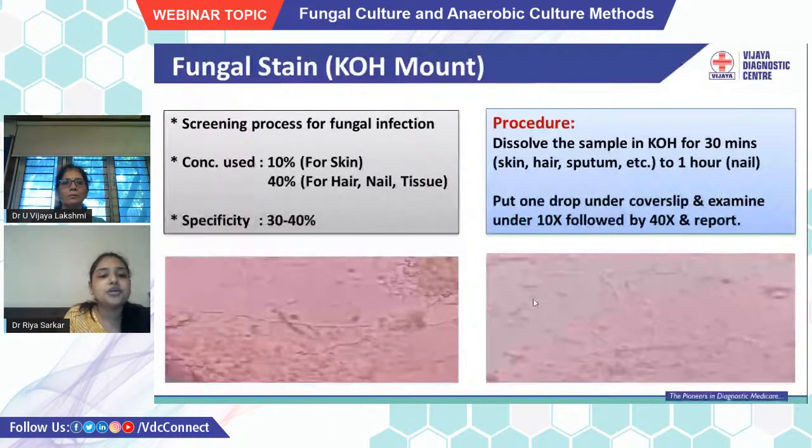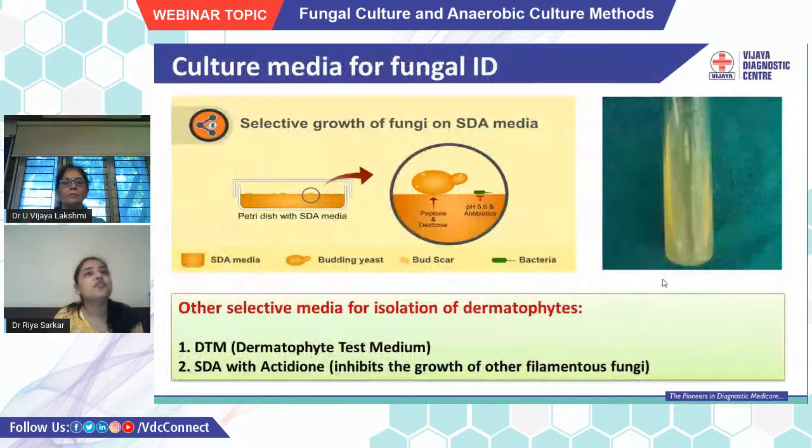I can show you the picture here. This shows thin hyaline hyphae-like structures under a KOH mount. So this we reported as fungal elements positive. Similarly is this picture. After this, we come to culture media for fungal ID.